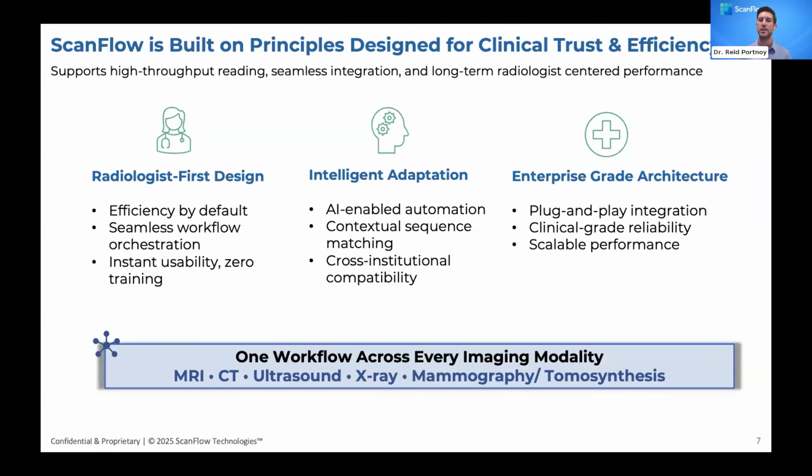We are built on principles designed for clinical trust and efficiency. Our seamless integration has long-term radiologist-centered performance. We have instant usability, and again, zero training. This is extremely important. We are built by radiologists for radiologists. We do not want to add another layer of training for radiologists. We want this to be a smooth transition so they can get to diagnosis.